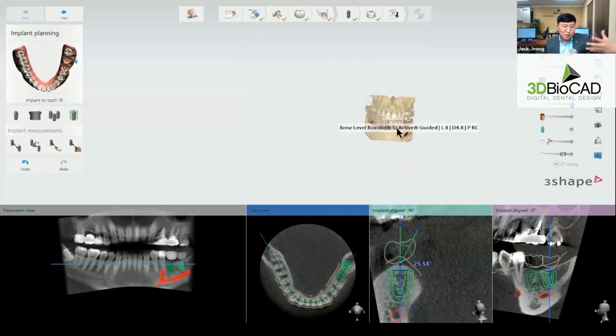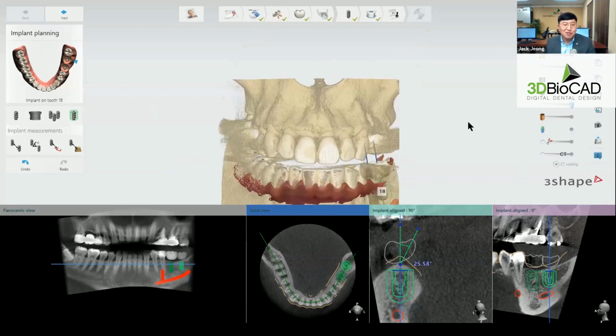And then with 3D work, maybe you guys have experience. Sometimes if we have a small mistake, we can find it too small, hiding somewhere. Is it too tiny here? Normally I just call it Ant-Man here. So if you have some issue and you lost your file in the 3Shape software, we always have some view buttons on the top right side. Once you click, it will just come back to the front view.